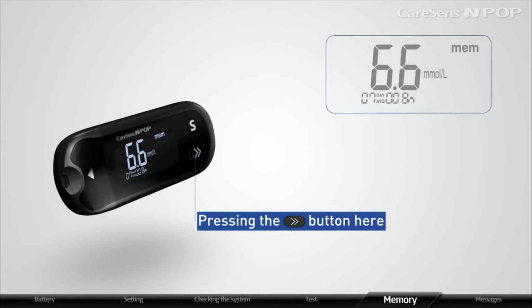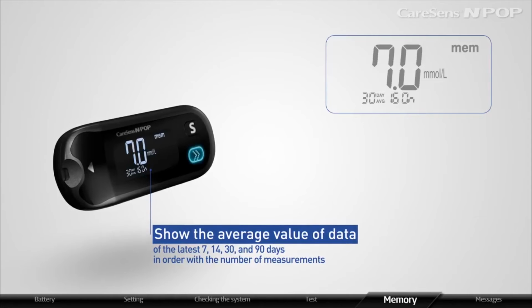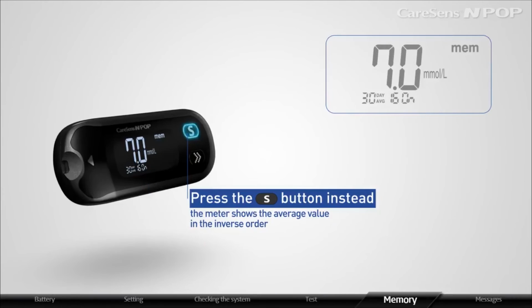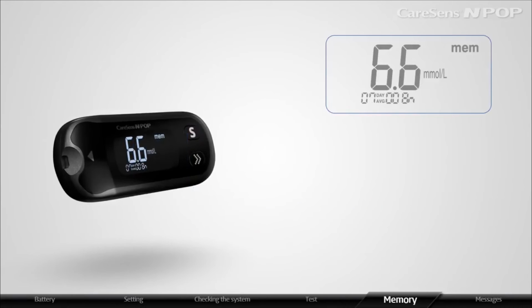When pressing the arrow button here, the meter will show the average value of data of the latest 7, 14, 30, and 90 days in order with a number of measurements. If you press the S button instead, the meter shows the average value of the inverse order.